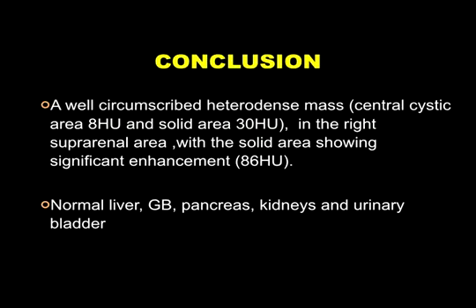diagnosis. But like we said, we don't talk about phaeochromocytoma alone, but the paragangliomas, and we can ably image them at ultrasound, MRI, and CT. Thank you very much.